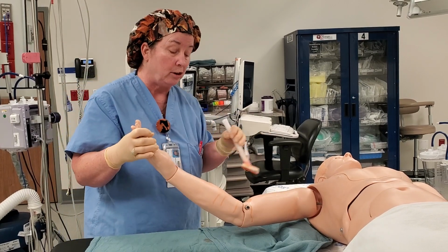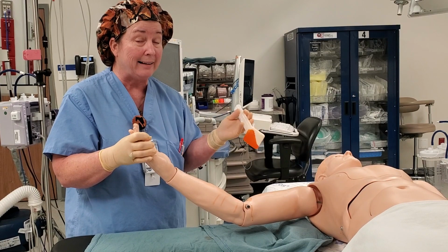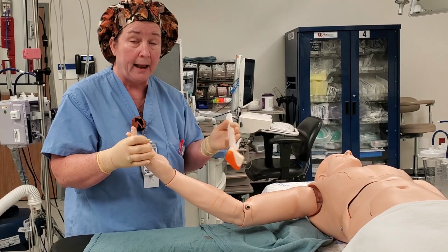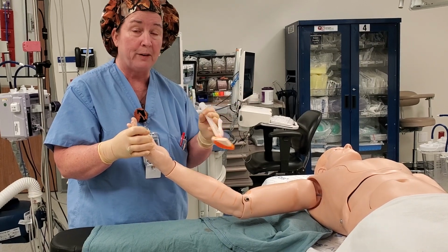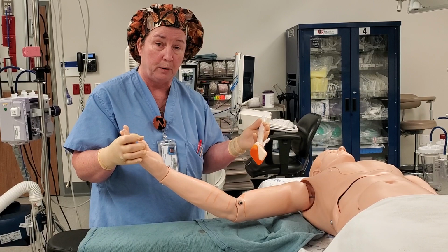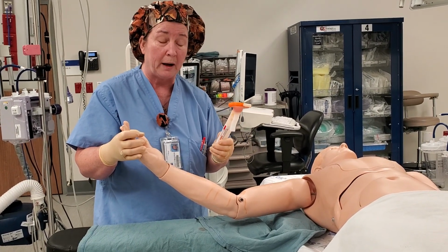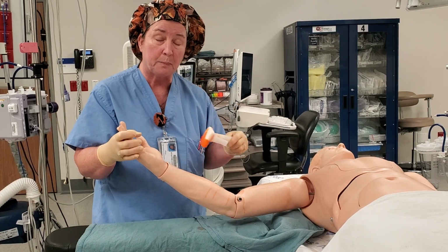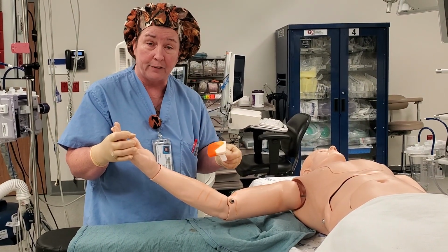So there's no way that you can do an extremity prep, an upper extremity prep, without using at least a minimum of 2 Chloraprep. And as we've talked about before, better a $4 Chloraprep than a $40,000 infection. So please use however much prep you need. Also remember, these only do a 12-inch by 12-inch area. So even though it's painting the area orange, it's not laying down the proper amount of chemical.